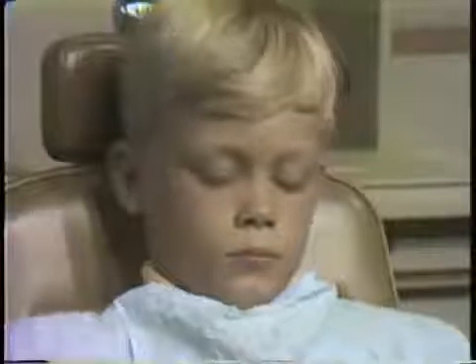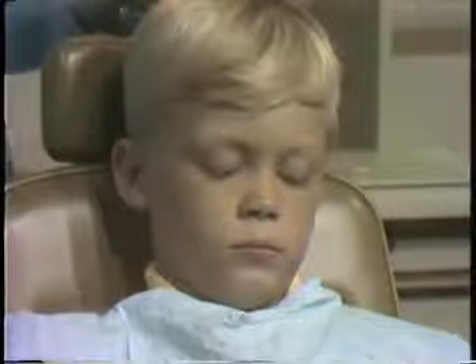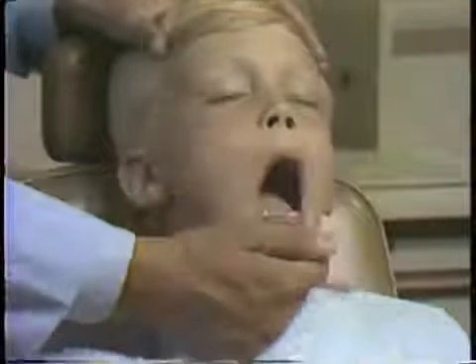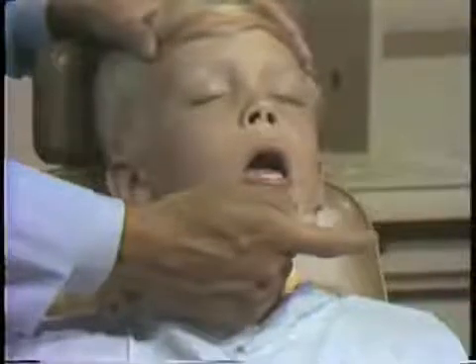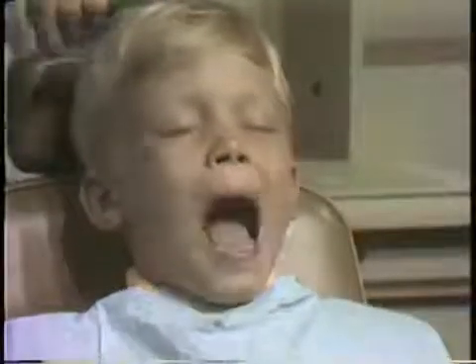The next part of the examination is the functional analysis. We know that Jeff has no crossbites, but we want to place him in centric relation and look for functional shifts. Relax your lower jaw — now let me close you and tap your teeth. You can see he has almost no slide at all. Checking for oral habits is always important, but not particularly so for Jeff because he doesn't have an open bite. Even if he did have an oral habit, apparently it's not significant enough to be causing any problem.